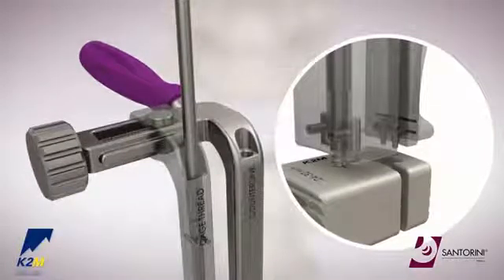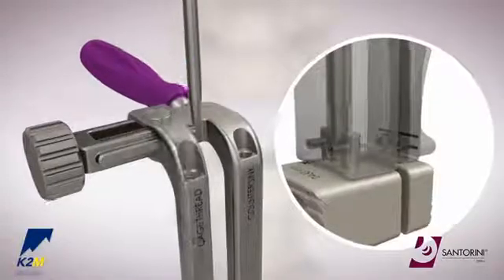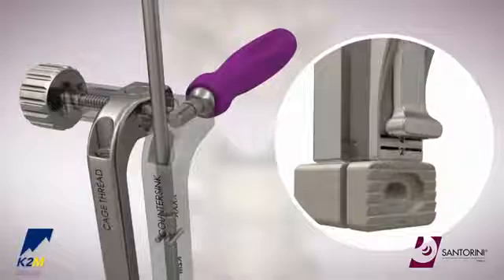Proceed to carefully finger tighten the pin. The size 15 driver can also be inserted down the adjacent distractor arm to adjust the stop between 0 and 4 millimeters.